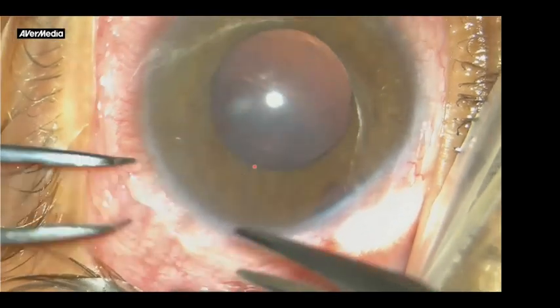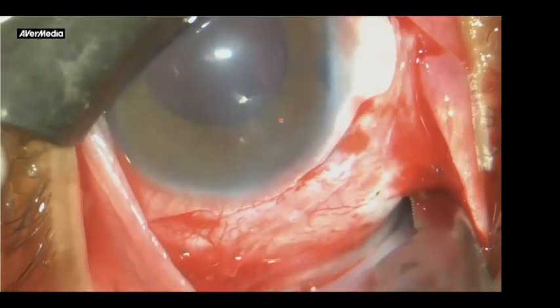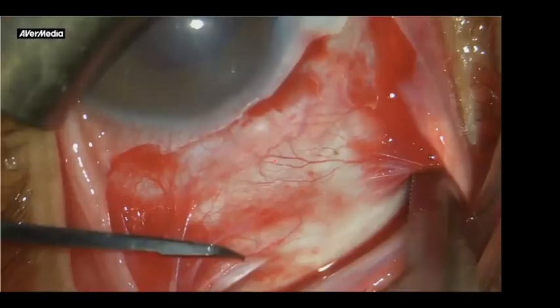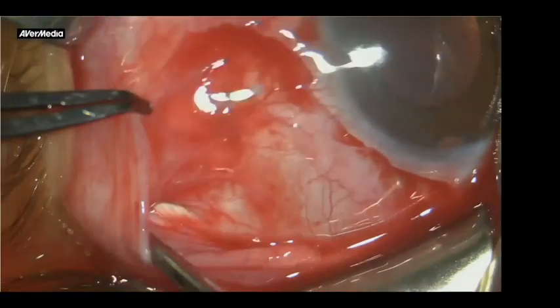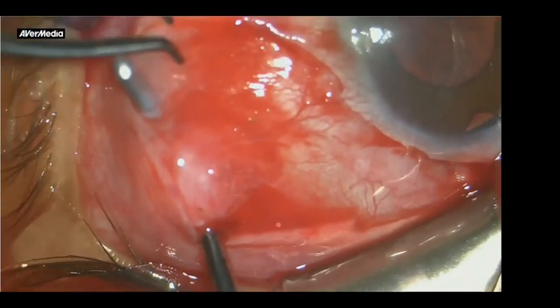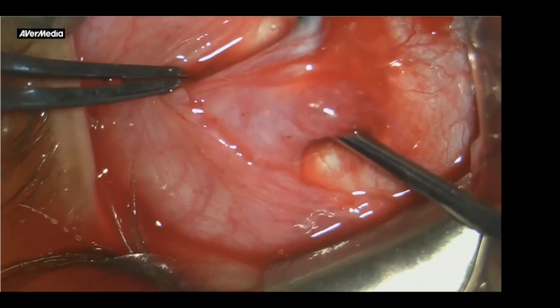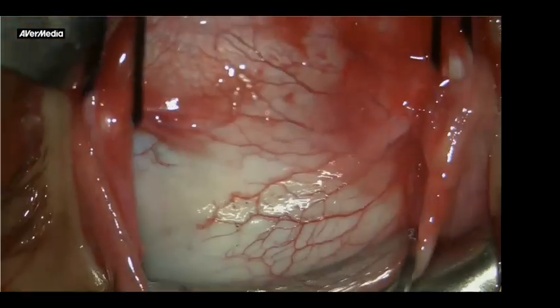So again, this is the video. Dissecting the conjunctiva, it was a recurrent pediatric glaucoma or juvenile glaucoma. So you can see a lot of Tenon's. And again, the artery forceps will help the separation. In this case, I just wanted to have good exposure by hooking the muscle, but I do this very, very infrequently. I use the corneal traction suture.